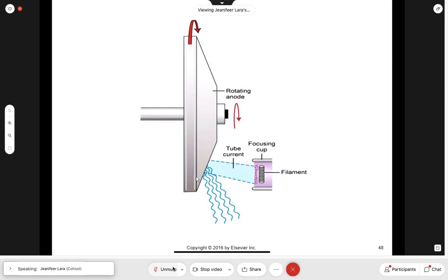Ms. Laura, so the voltage or the kVp, that's the potential difference, right? That's the potential difference. So we have kilo. We were talking about 150 kVp. So you're talking about 150,000 volts being applied to this anode that creates more attraction.